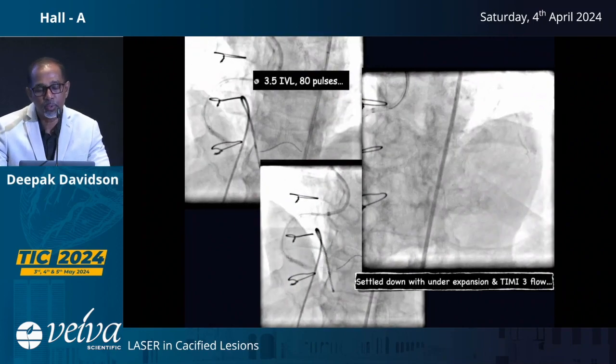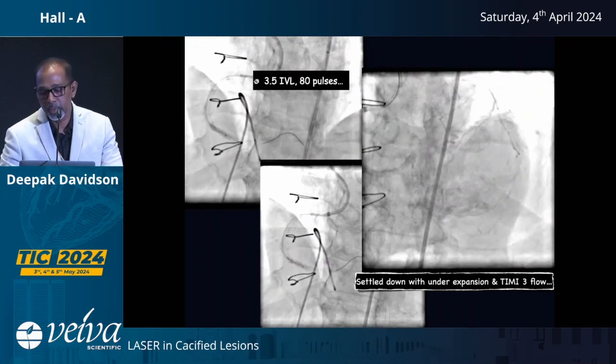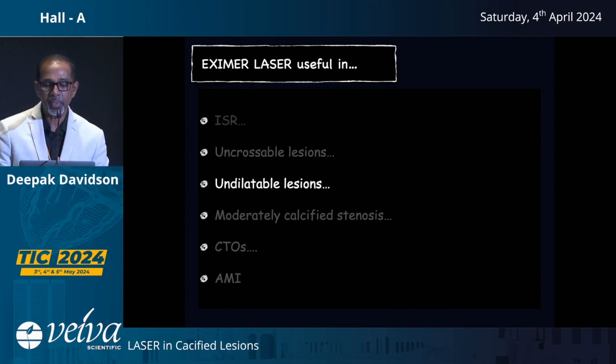Despite doing laser, we had to use non-compliant balloons, OPN balloons, we had to use IVL, and that is how we were able to achieve this sort of good results. So primarily laser acts as a complementary tool in managing these sort of extremely calcified lesions.